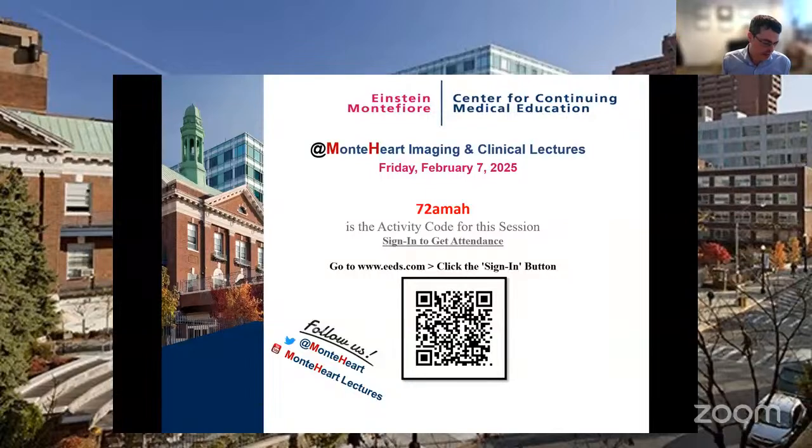In some of the deep learning studies, when we were looking for case studies to include, one had increased RV uptake, and that was the only sign of left main disease. So it was missed by the expert reader. It would have been missed by me if I was reading it in a stack, but it was picked up by AI and it ended up being balanced three vessel disease. And in retrospect, it had increased RV uptake. So maybe it won't be perfect, but it might help you clue into some of these other traditional findings that we are always looking for, but sometimes gloss over.